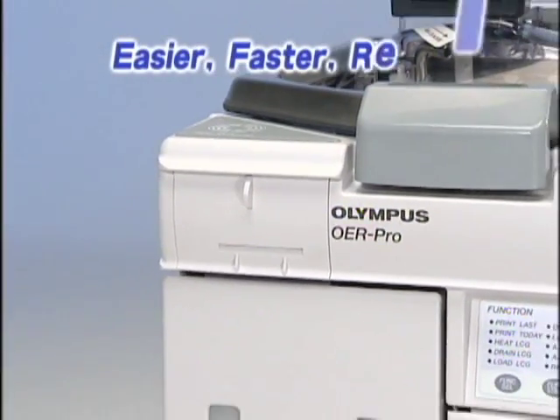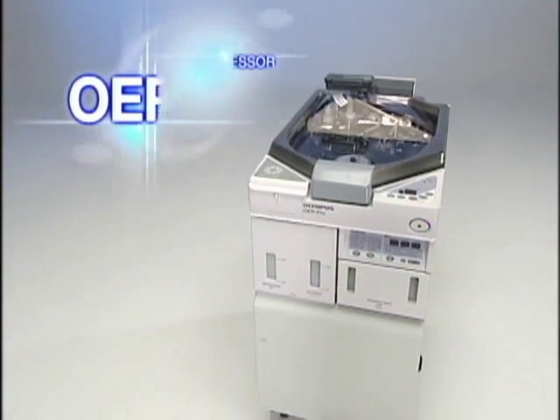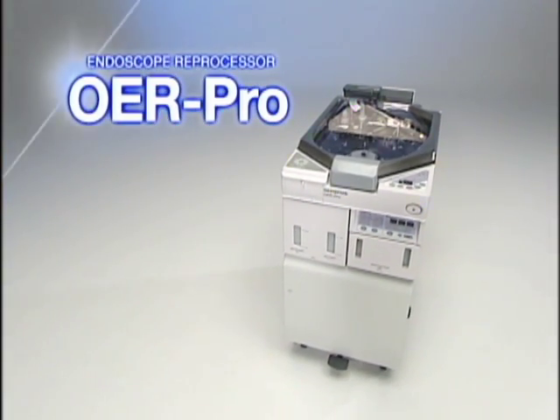Easier, faster, and reliable. The ideal reprocessor for your Olympus flexible endoscopes — Endoscope Reprocessor OER Pro.